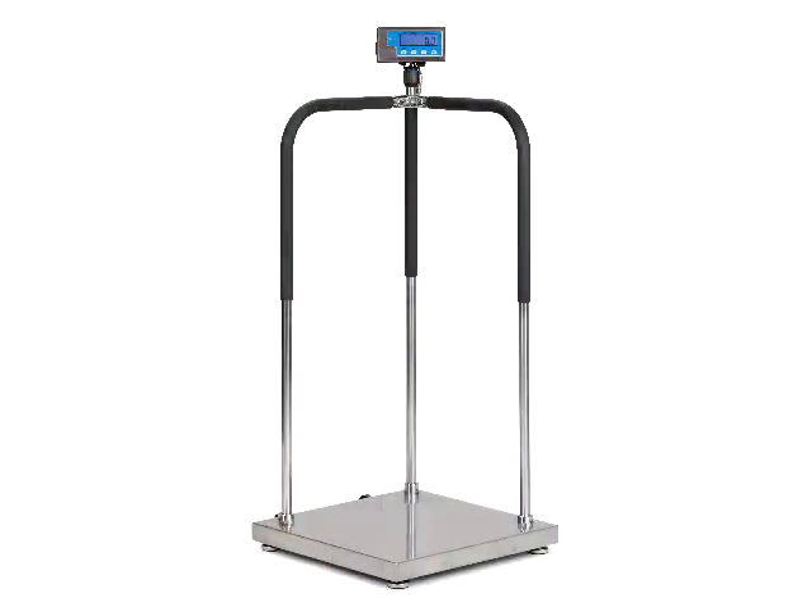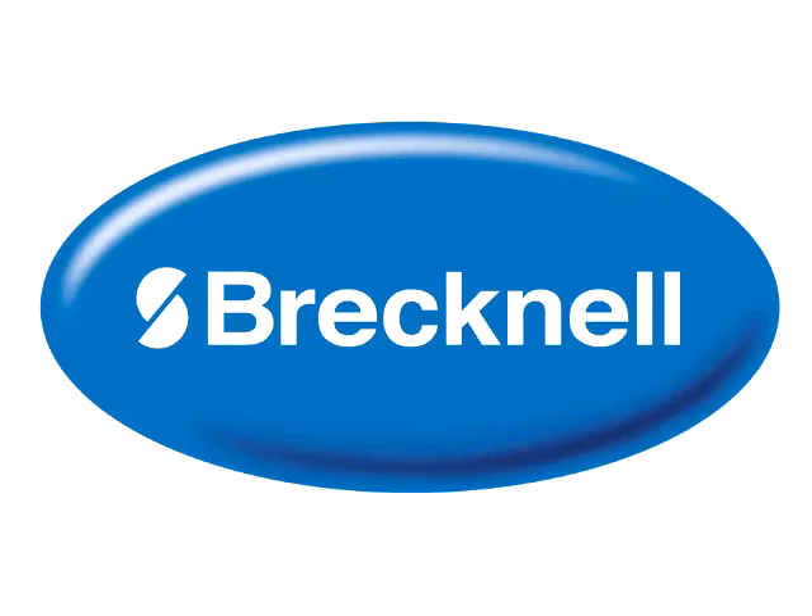Assembly of the MS140 Medical Scale is then finished. Thank you from Brecknell.